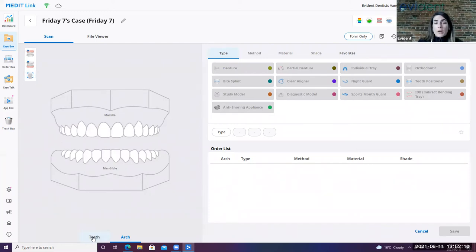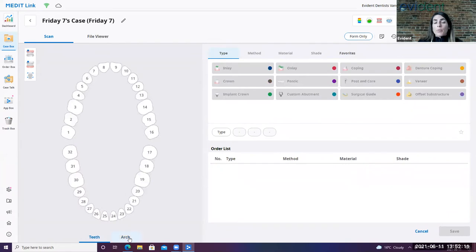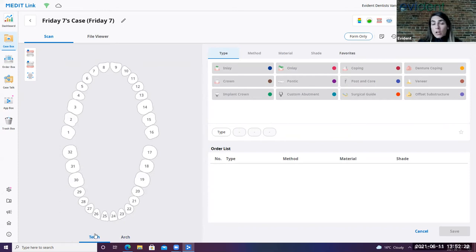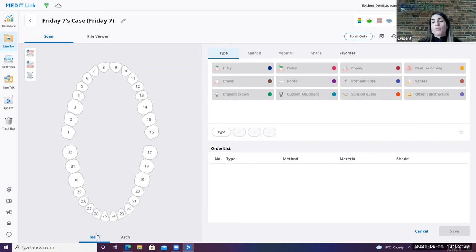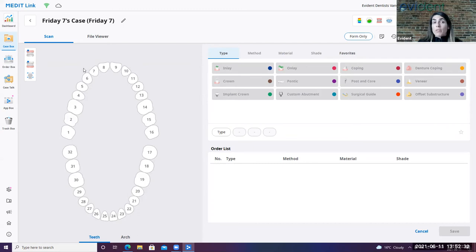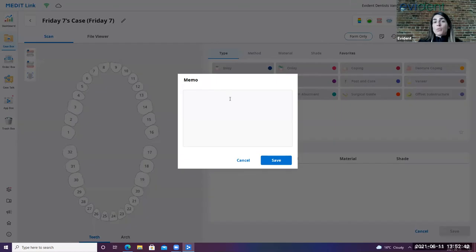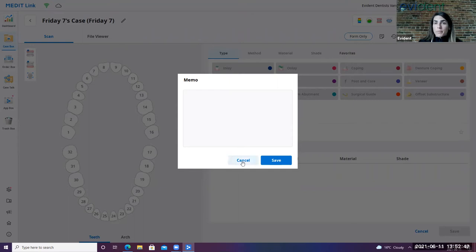With the Medit as well, it is important to acknowledge that you are not able to combine the prescription for teeth and arch at this time. You do need to be able to, I call it designating what your major treatment is, and then how do we deal with their minor treatment. So we go through all of this in our training regimen. But, for example, if you have a case that you're doing crowns on six to 11, and you also need a good night guard, then I recommend preparing your prescription for your major treatment, which will be your crowns. And then in this little button right here, it's called the memo button. This is where you will indicate the lower night guard as well, so that your lab has that information to be able to proceed with both.